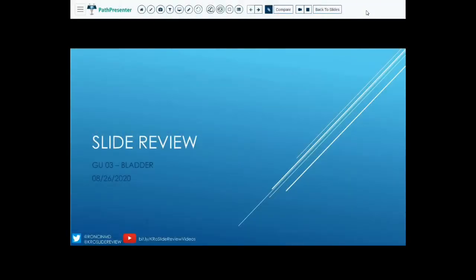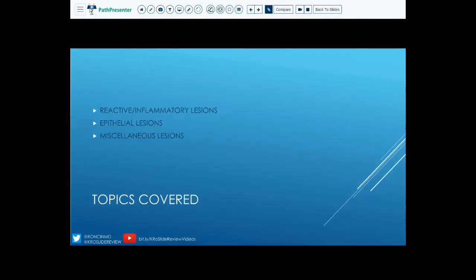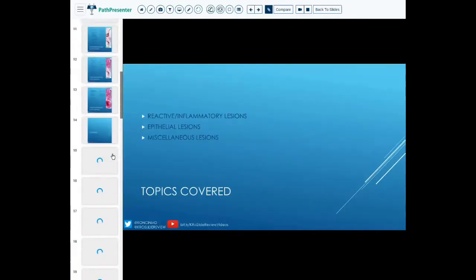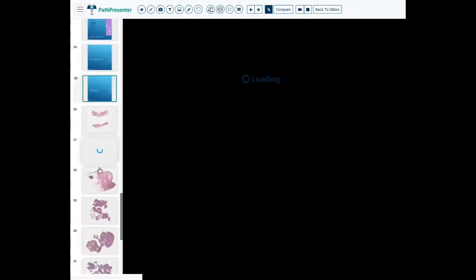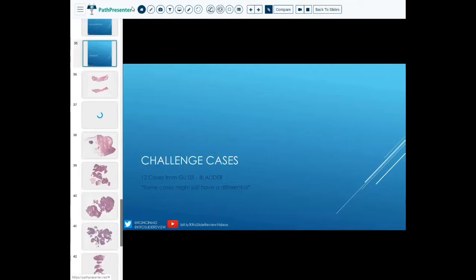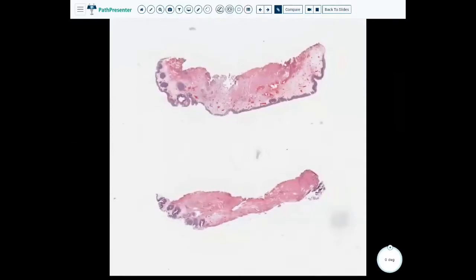So today we are going back to our GU series to go over some bladder lesions. And we just have our standard disclaimer at the beginning here. And as always with our challenge cases, we're not going to go over the lecture material because you already have access to that. But we have 12 cases to go over for our challenges. So let's get started. Case 1.